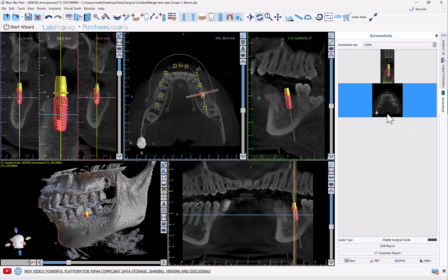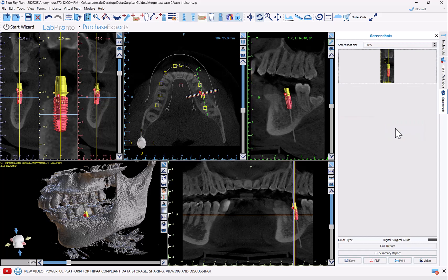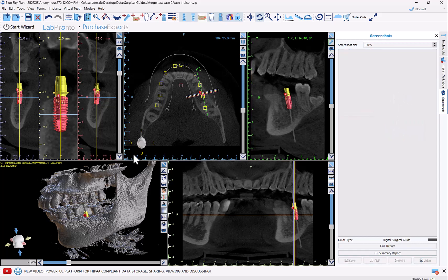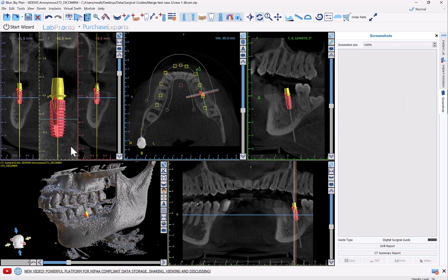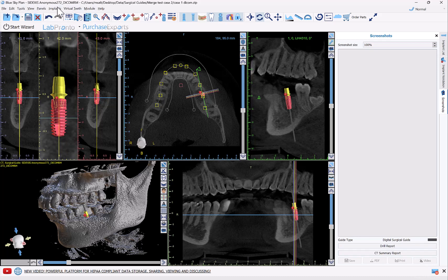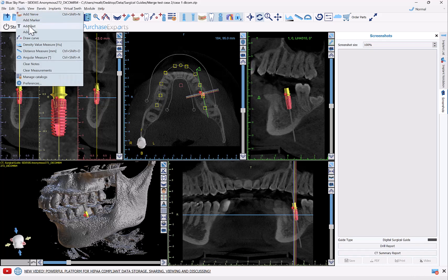If you want to remove an image from the basket, right-click and you have different options: copy to clipboard, save, remove the image, or remove all images. If we're going to be printing out screenshots for the actual surgery, first we go to Tools > Add Text.